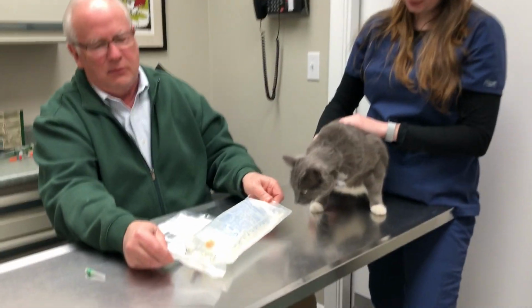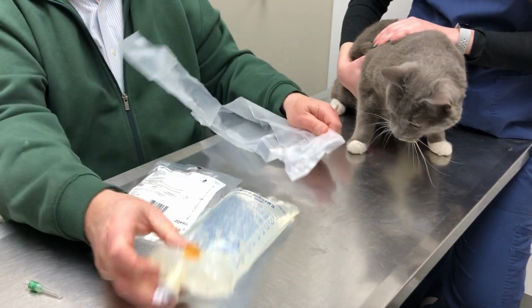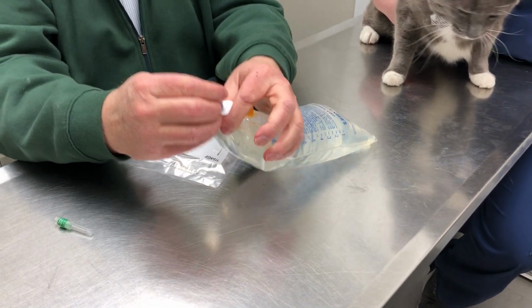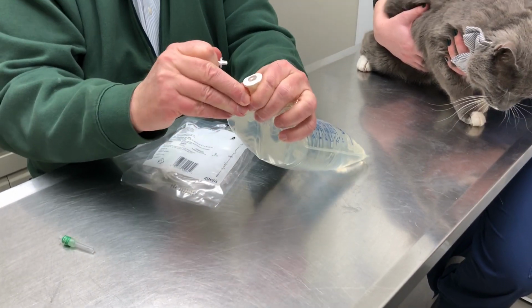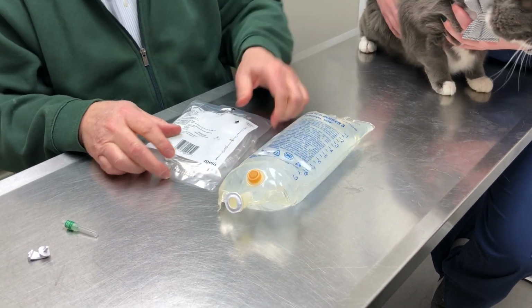So first, this is lactated Ringer's. It comes in a big plastic container. We're going to rip that open. So that's what the bag looks like. And you'll see there's this plastic cover. We're going to take that off, exposing the opening to the IV bottle.